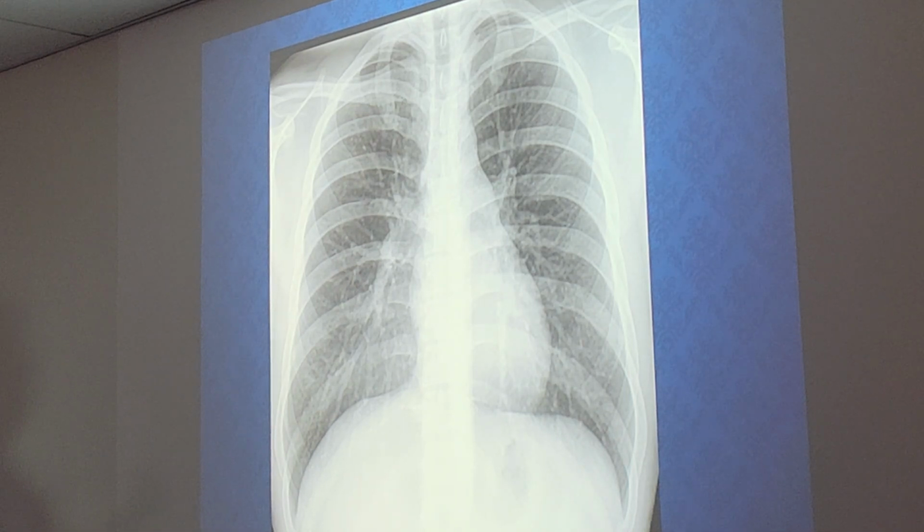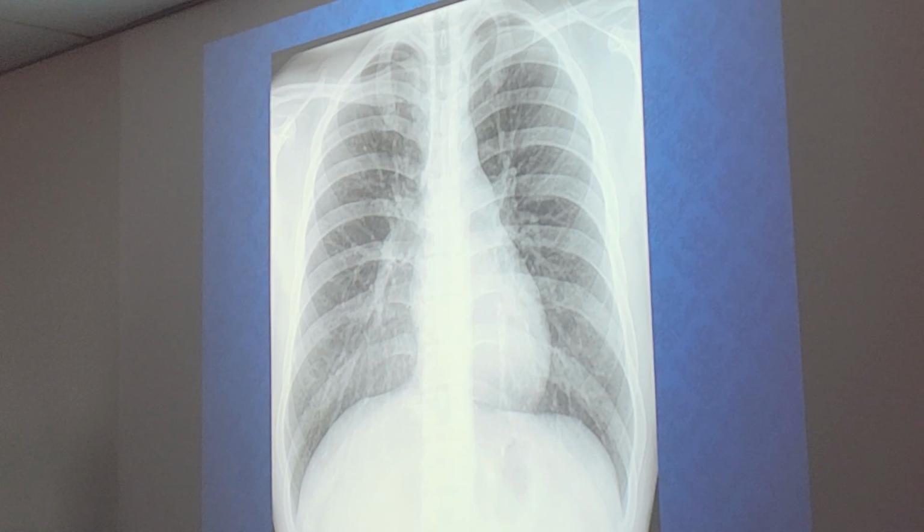Another thing was the clavicles, like Mr. Fong mentioned. In an AP, the clavicles tend to be above the apices. On this image, you can see that it's below. Does the first rib also look different? All the ribs will look different on AP and PA. What's the logic behind the clavicles? I don't understand why they're in different spots.